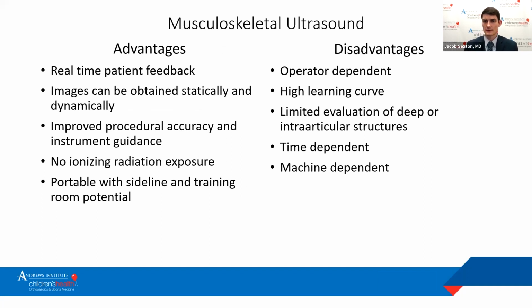So quickly talking about musculoskeletal ultrasound, the big question is, what are the advantages and disadvantages, and why would I use it over plain films, MRI, CT scans, and other diagnostic imaging modalities? The real big thing for me is that you get real-time patient feedback. This is a dynamic study in real time where you're actively moving the patient and palpating the structures as you're performing ultrasound. So the patients can give you feedback during that time to tell you exactly where things are hurting and where things are not hurting, and that gives you more confidence in pathological findings when you find them.